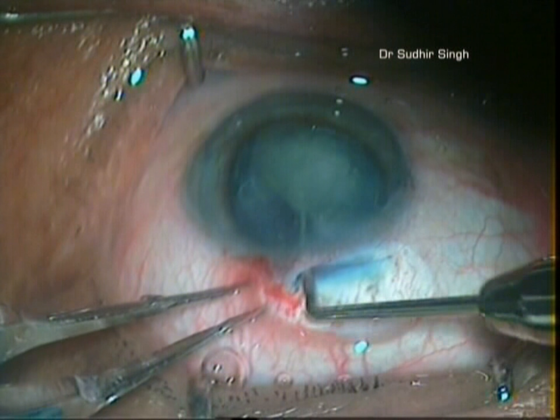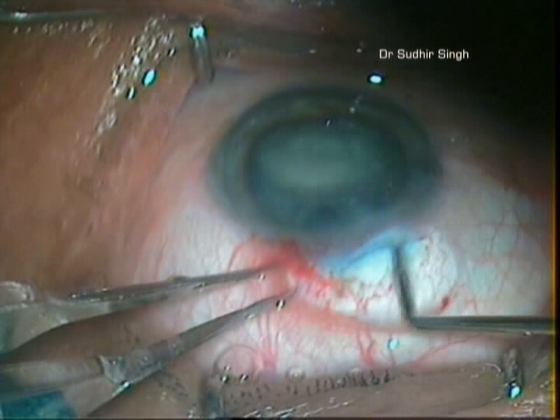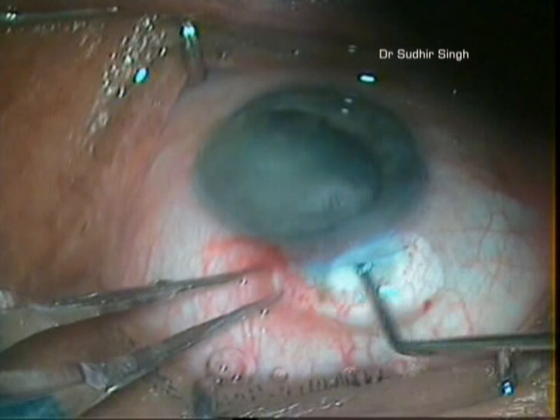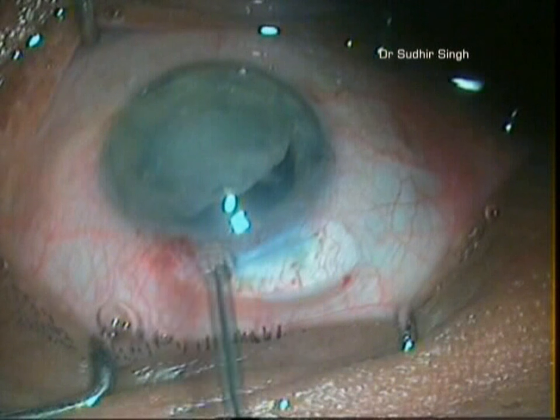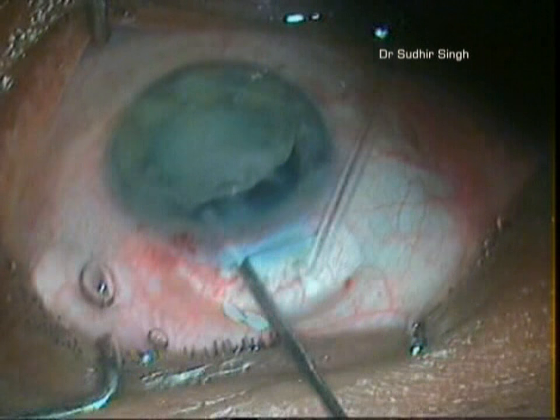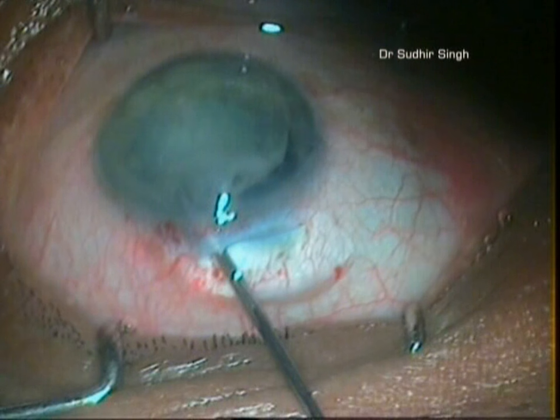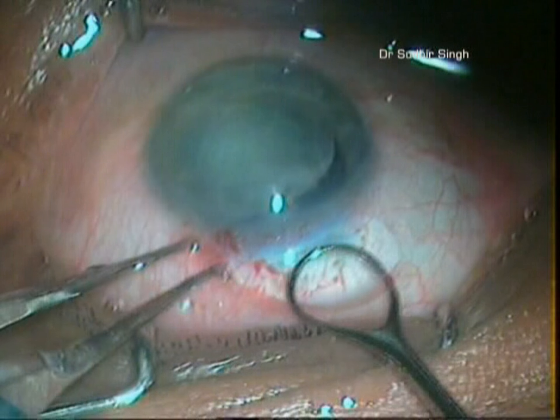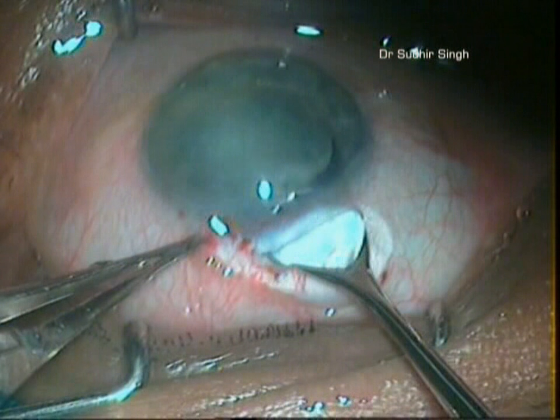The nucleus is prolapsed into the anterior chamber with the Sinsky's hook. Enough viscoelastics is placed between the cornea and the superior surface of the nucleus, and between the inferior surface of the nucleus and the iris. The globe is stabilized with tooth forceps and a vectus is introduced through the tunnel and positioned between the iris and the nucleus.